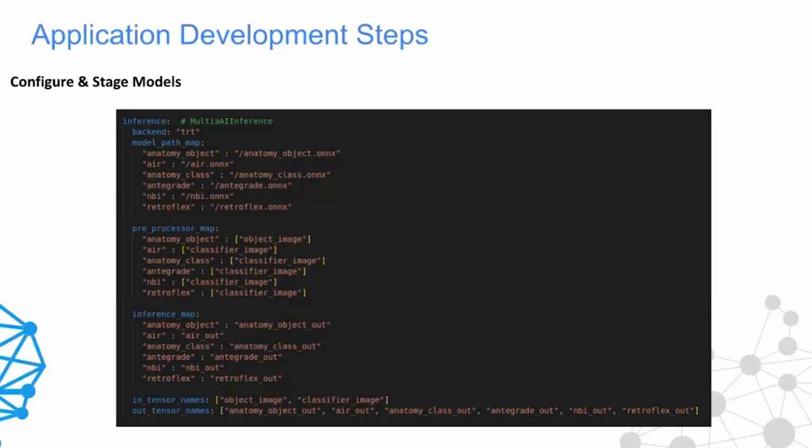Within the Holoscan context, the SDK comes with the multi AI inference operator, which can be configured directly via key value pairs. Over here we are giving the model path map, providing all the ONNX paths that need to be loaded during the runtime. Similarly, there is the pre-processing map, which maps which model's input is provided in which variable. And finally, the inference map to map the inference to the output variables.